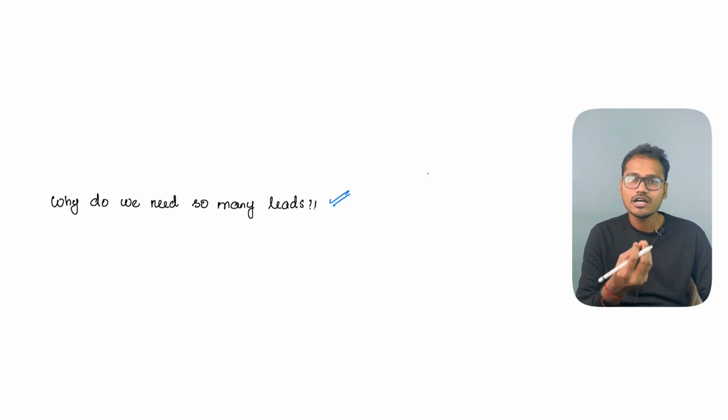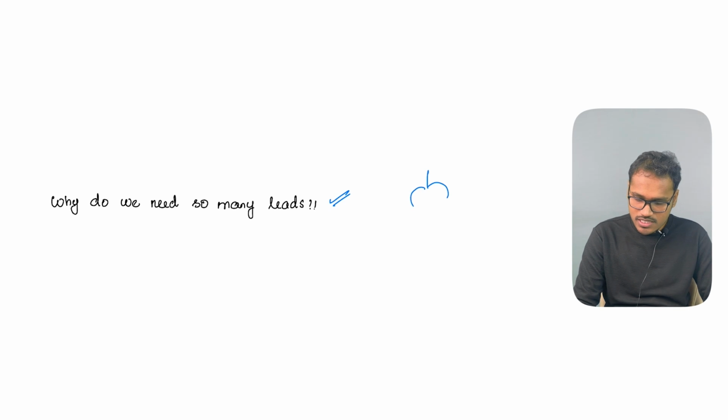so that whatever abnormalities are there which is not captured by one camera, it will be captured by the other camera. For example, you have an apple and it has a rotten surface on its left side, and you are viewing the apple from the right side. So will you be observing this?